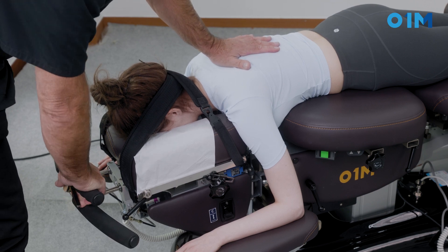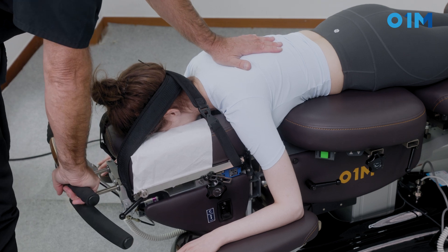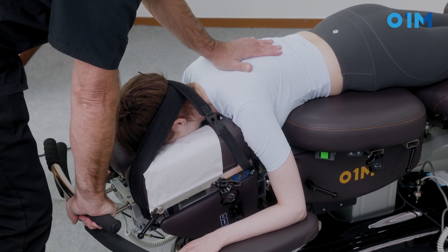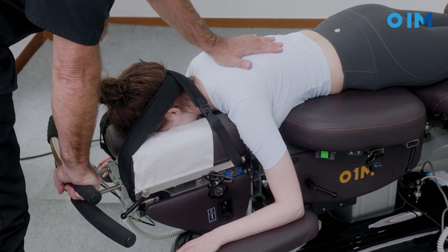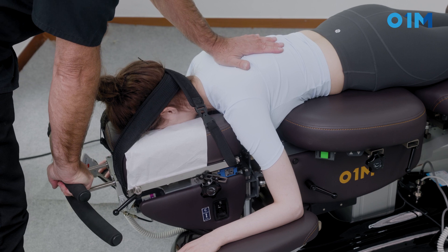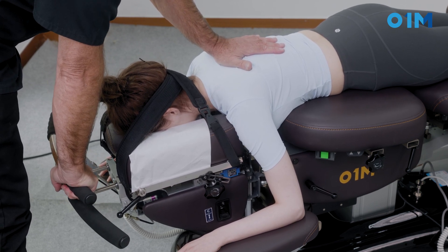In certain cases I will want to add a little rotation, and I will be able to use rotation at the same time as traction. I will also be able to raise the whole headpiece in certain types of patients — particularly big-chested patients.